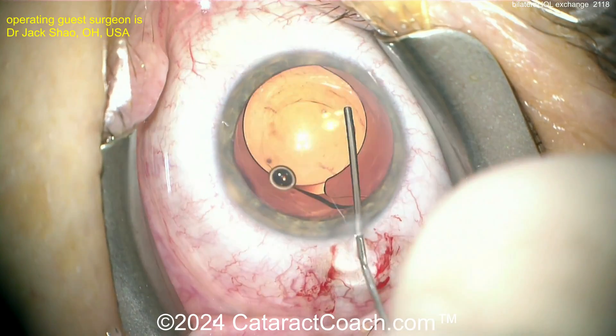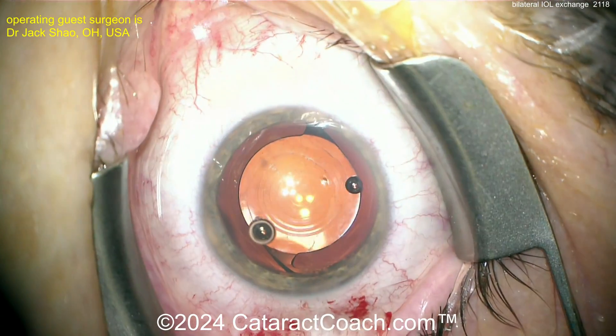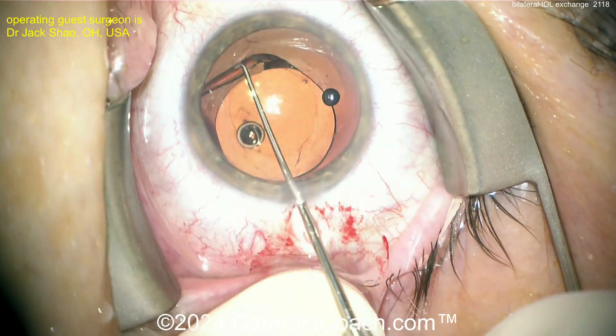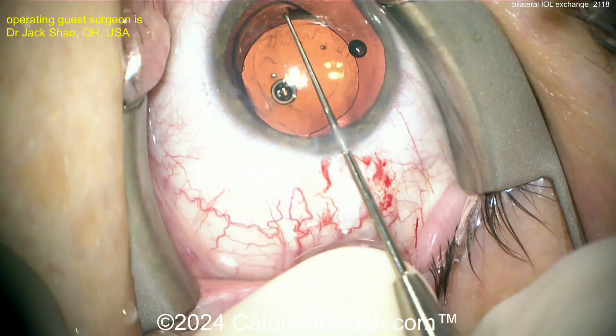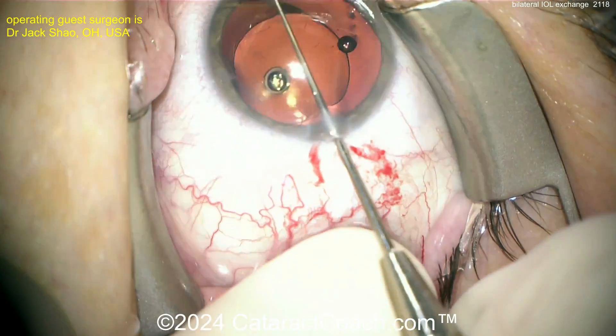I literally fielded an email from a patient recently who was off by half a diopter — from 10 diopters of ametropia pre-op — and that's what you have to deal with. Here again this lens is dissecting pretty easily; I'm guessing this patient is not too far into the post-op period.